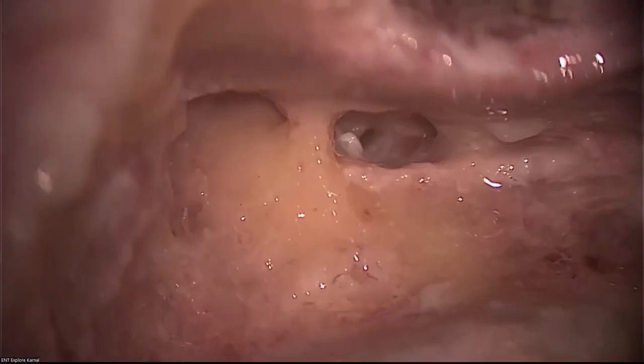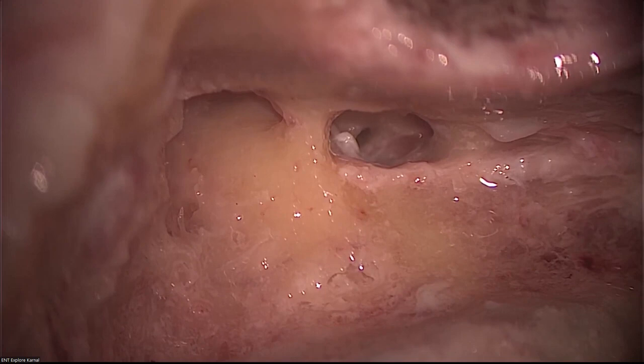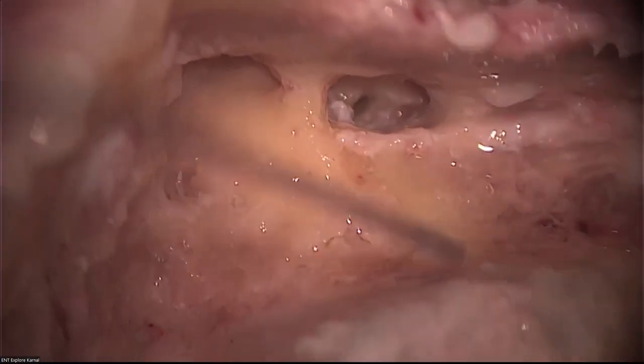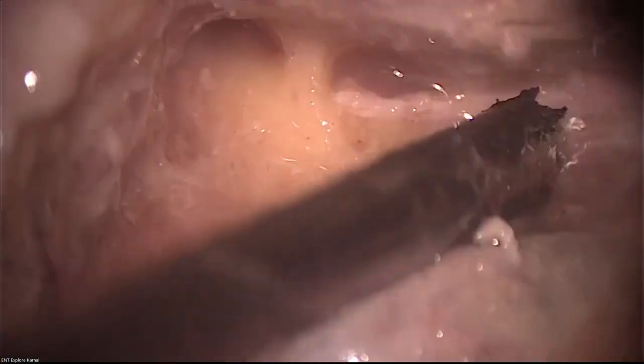So let me first remove the canal wall and show you the entire cochlear anatomy. So you will do canal wall down now. Just to show you the anatomy. If we have to implant a patient, you can implant right now without any issues. But just for the sake of demonstration of the cochlear anatomy, I have to go further.